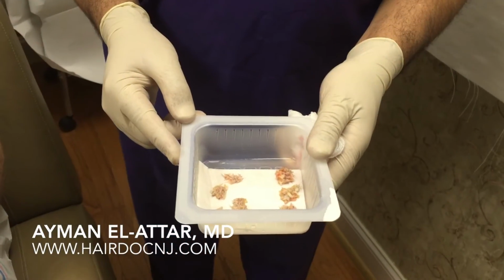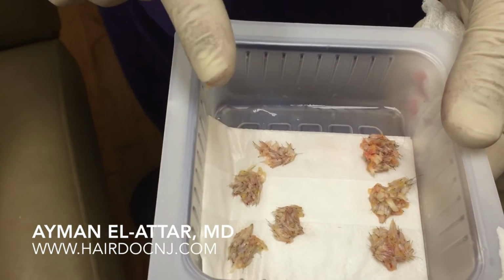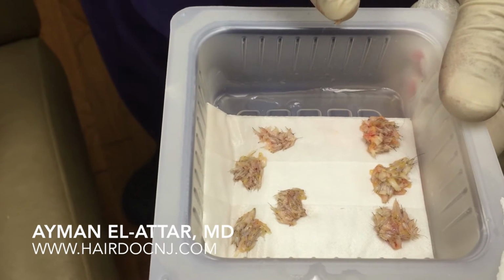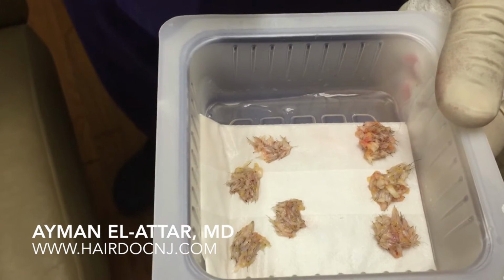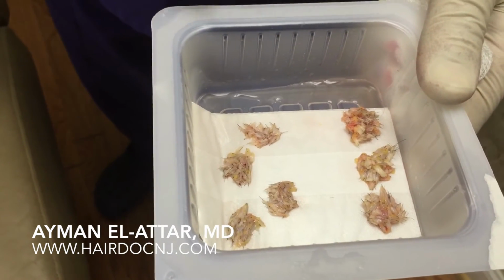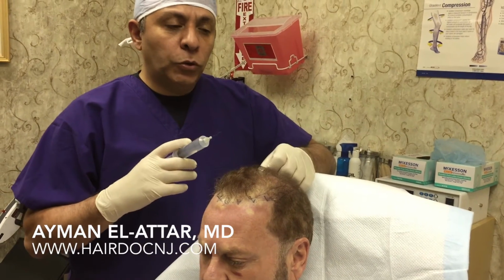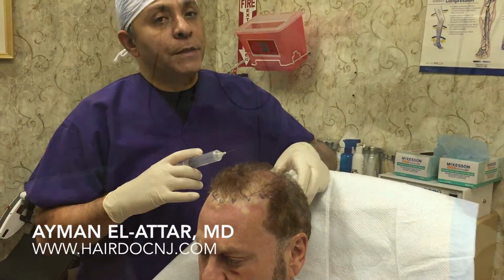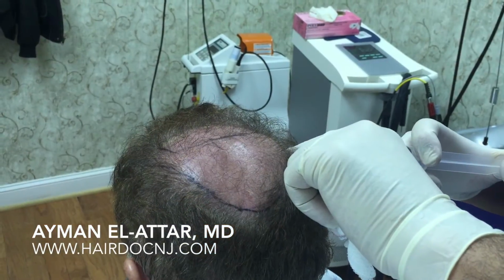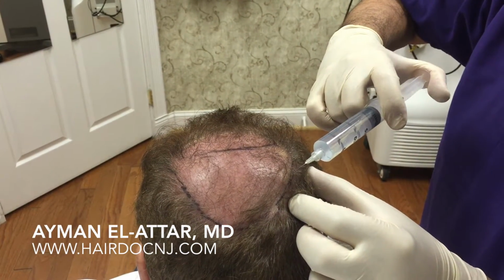This is actually our grafts. As we see, we categorize the grafts to 1, 2, 3, 4 hair grafts, and a little bit of bigger punch grafts that we use for just coverage of the central portion of the vertex as well. As we see, the area here is completely blanched because of the epinephrine effect. So the next step I'm going to do is to tumesce the vertex area with epinephrine to allow good tumescence of the back, where we're going to be placing the grafts in the vertex region.